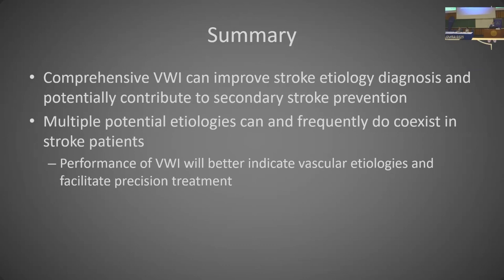So comprehensive vessel wall imaging can improve stroke etiology diagnosis, and it can contribute to secondary stroke prevention. Multiple potential etiologies can and frequently are present in a patient. And in that setting, vessel wall imaging can really help in terms of better directing patient care and treatment.